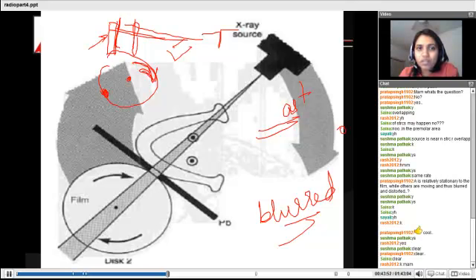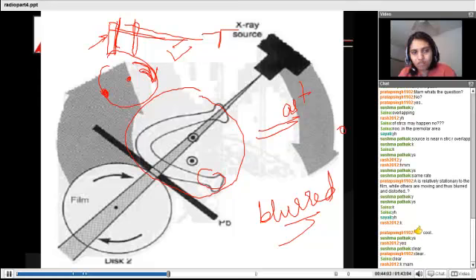That was so simple because the object was round. But here the object is not round. So to achieve this scenario, so that this part is focused and this part is focused, every time we need to select a center of rotation that is favorable so that recording of this part happens.